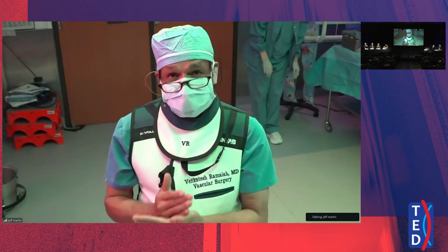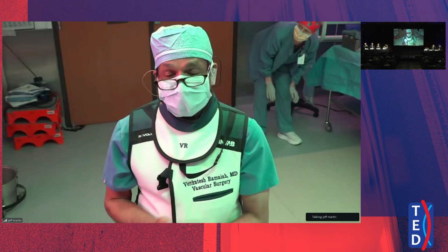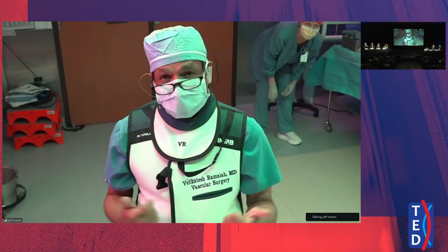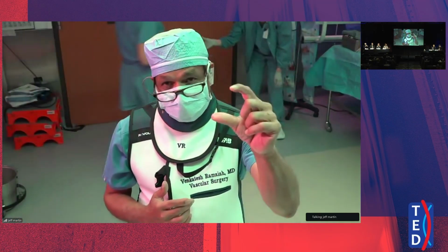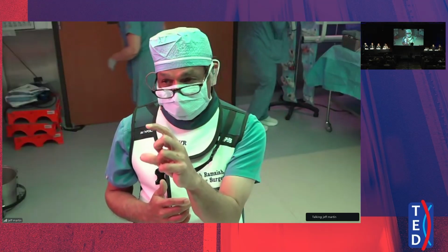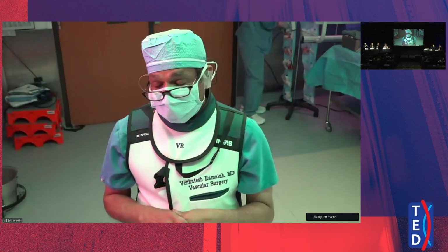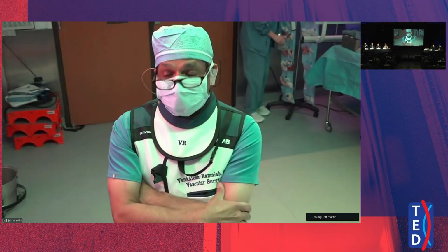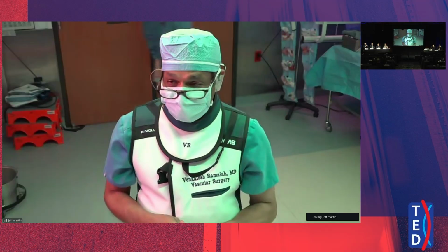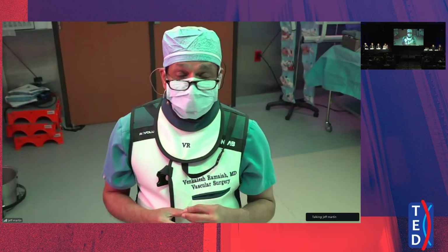And this guy had an attempted endovascular opening of his long segment SFA occlusion, and this failed, and then he came here. Because of lack of vein, otherwise he may be a very good candidate for a bypass. He's got good inflow. He had a good, nice popliteal below the knee and a single PT going down. And so I think that was one option. But again, we weighed the risks and the benefits, and he opted for this, and I think we'll follow him very closely. Post-op, I put these patients on 2.5 of Xarelto and then also Plavix.